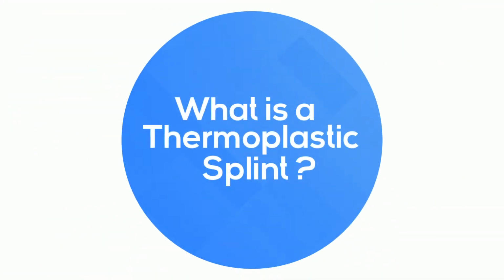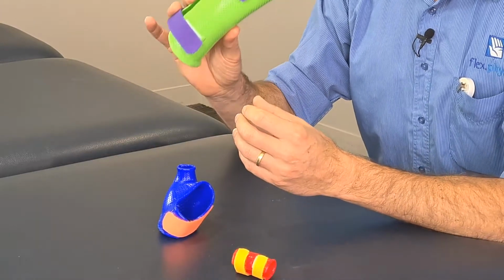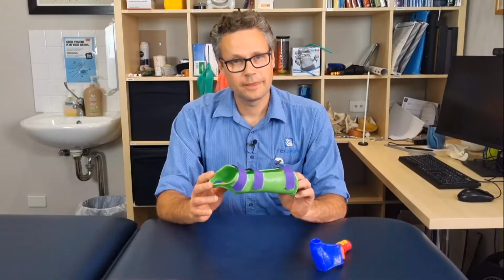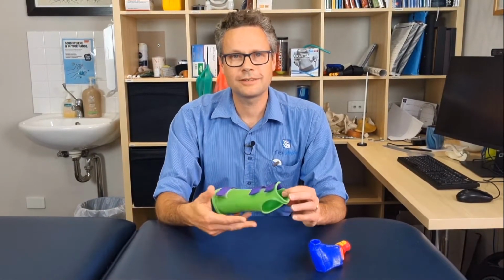Let's start with the basics. What is a thermoplastic splint? Any kind of splint, brace or orthosis that's made from a plastic that is designed to go soft when it's heated up. In this case, low enough temperature so that it can be applied directly to the patient, and they can be used to immobilize, to support, to protect, and to give pain relief.